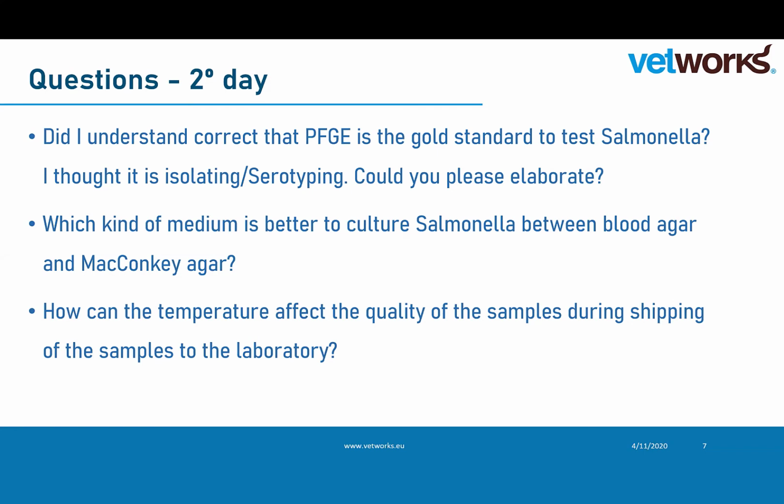Well, I think you have to be careful with temperature and humidity, as you say, because of Salmonella. The reason why you do enrichment is that, in fact, Salmonella doesn't like to grow, so you have to keep it in a good way. And the danger, if you don't keep your sample well, is that you will have overgrowth of other bacteria and you will not find your Salmonella anymore.